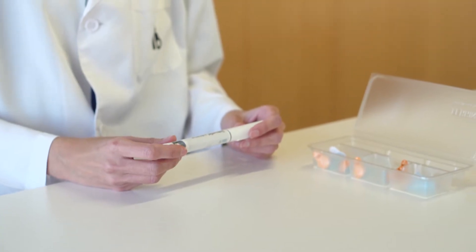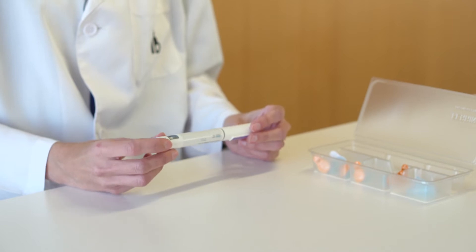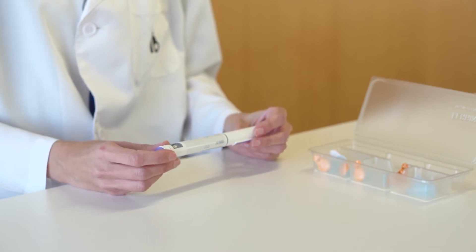After opening the container, you will find a prefilled pen — that is, medication is already inside the device, ready for use.